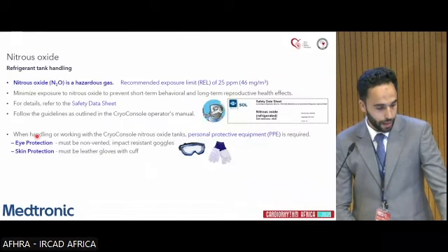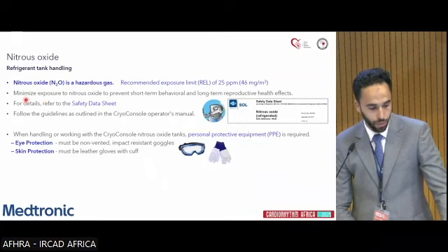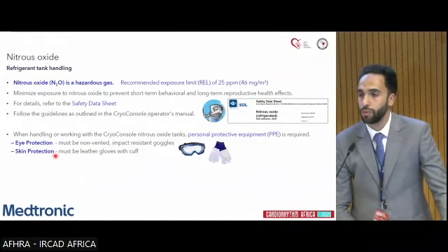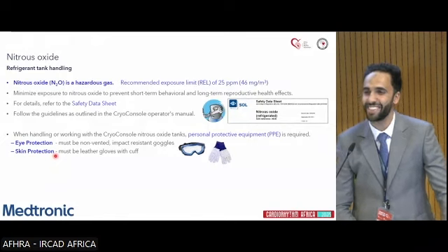For safety in handling nitrous oxide, the hazard is minimized. We recommend minimizing exposure to nitrous oxide to prevent short-term behavioral and long-term reproductive health effects. And the last one is you have to wear eye protection and skin protection when you change the tank.